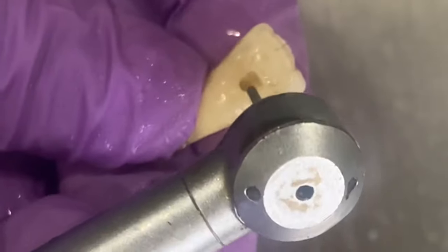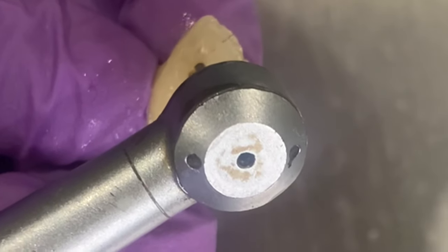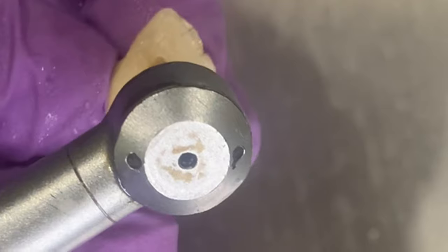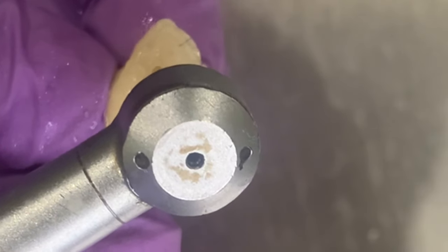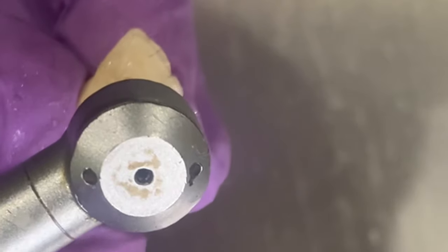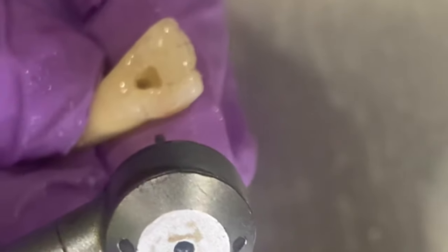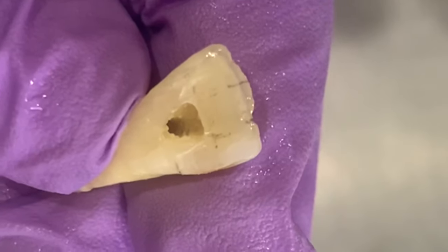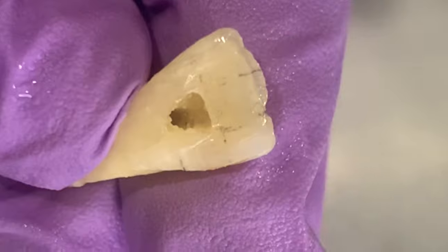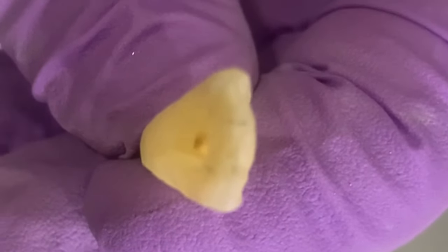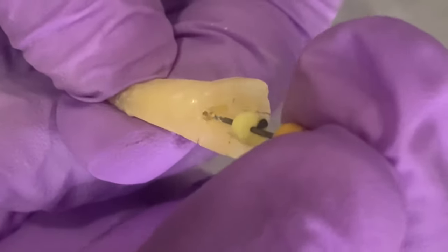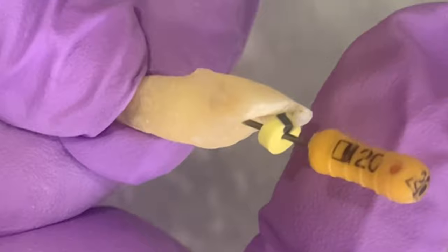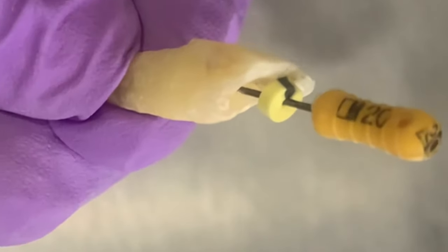Now we will remove all the overhanging enamel or dentin that may be present, and we move from inside to outside motion. Now this procedure makes your access cavity walls confluent with the lateral and the incisal walls of the pulp chamber, and this allows the access cavity to be in straight line to the root canal. This is how we complete our access cavity preparation, achieving a straight line access to our root canals.